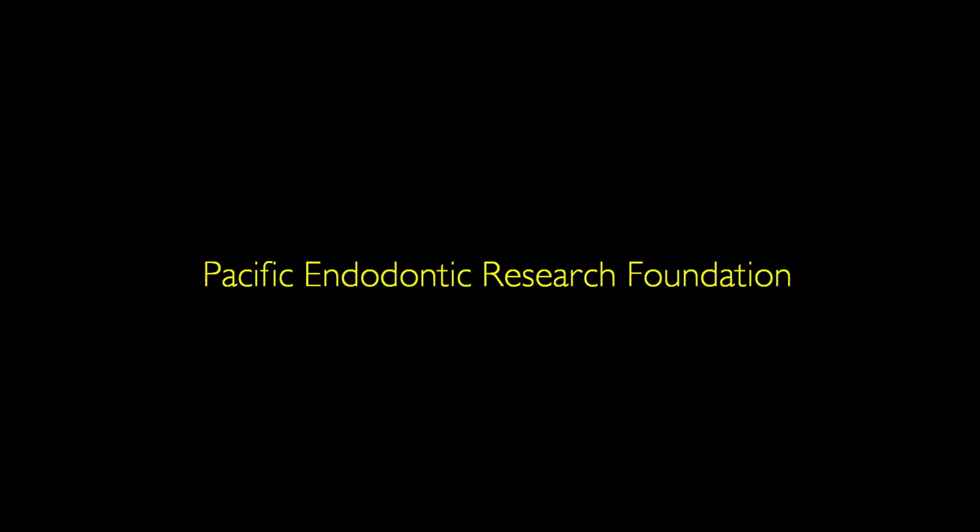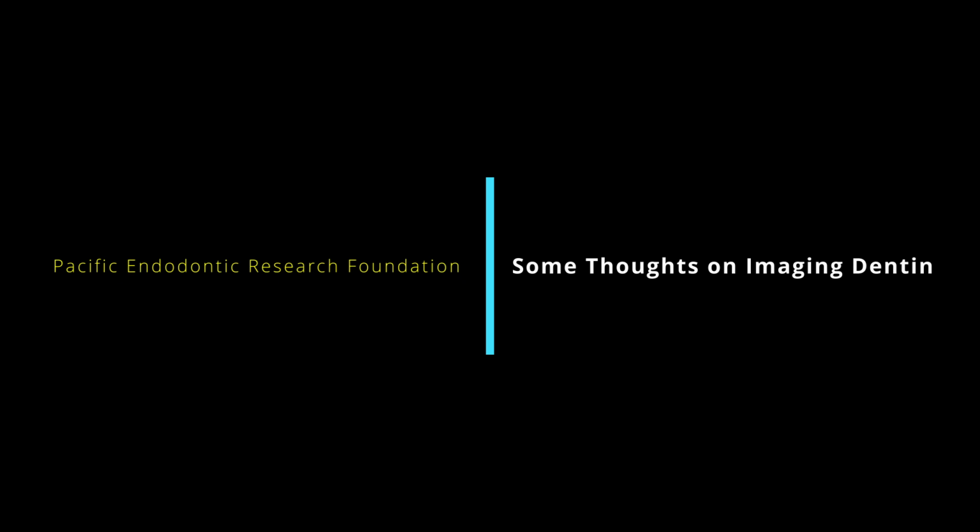I thought I'd put together a kind of synthesis video of what we've tried to teach over the last 5 tutorial sessions in trying to evaluate enhanced irrigation devices in an in vivo environment. If you followed these tutorials, putting all this together may help you crystallize some of these ideas and make your image interpretation task a little easier.